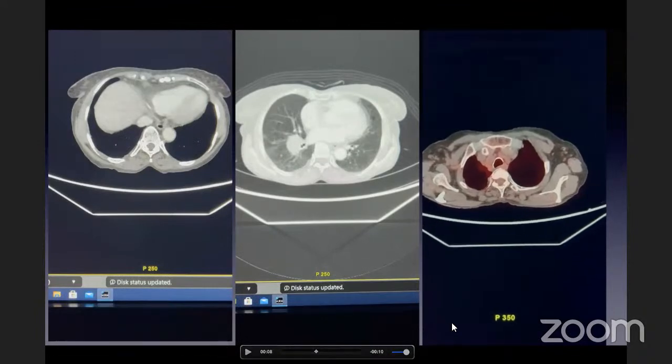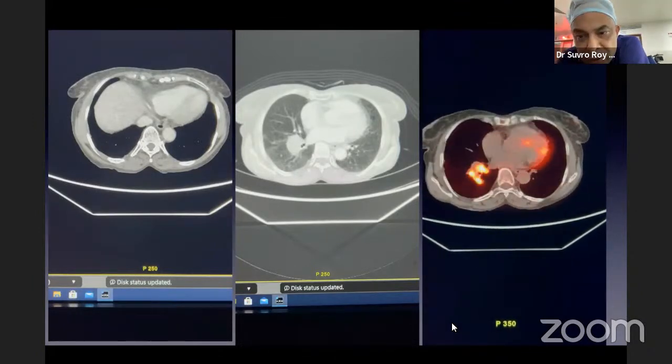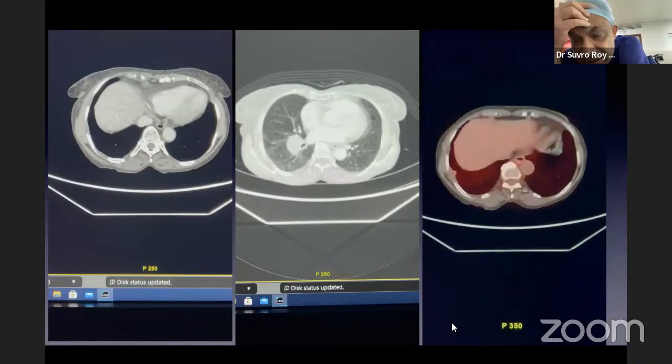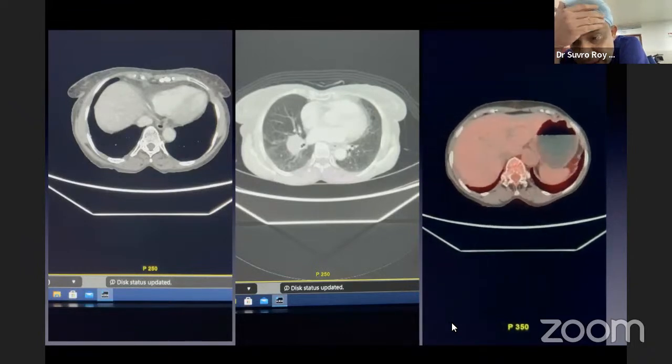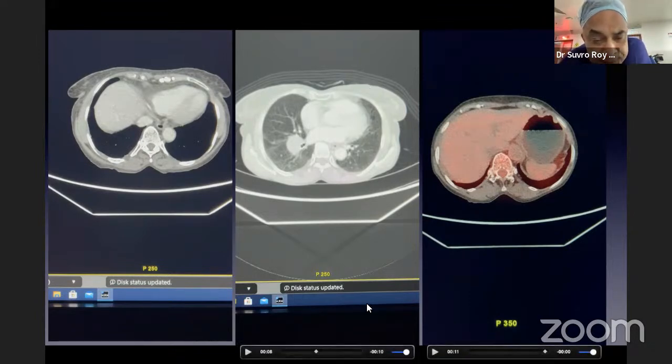Yes, sir. Please of course, we also have got access to PET, and we can see that both of those two nodes and this particular pulmonary mass is hot. And of course, PET would be another very good way of distinguishing between what is the tumor margin and what is the obstructive atelectasis. However, of course, I know that you don't get access to PET at the time of planning, because you have to do the planning on CT. So I will show you some more tricks in a second.